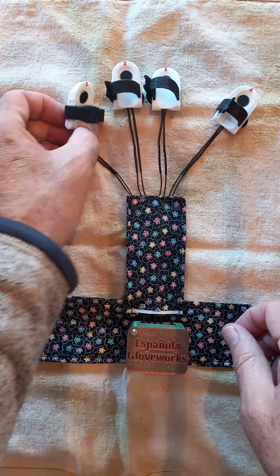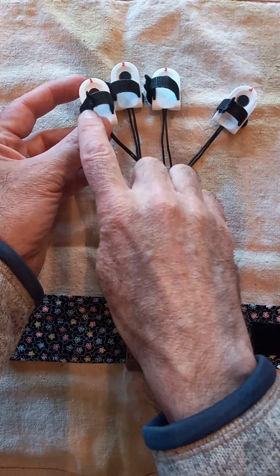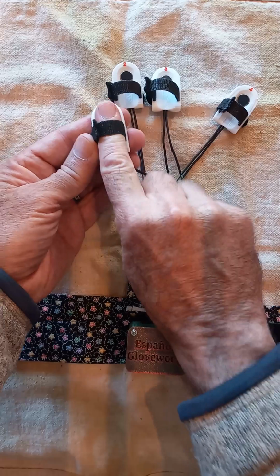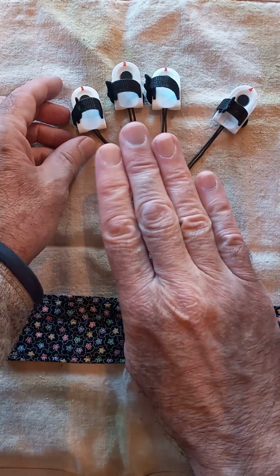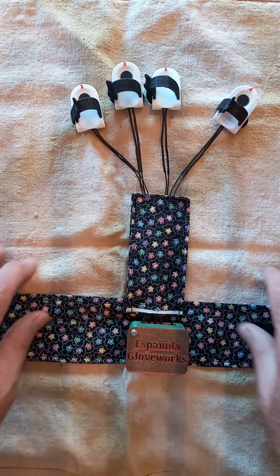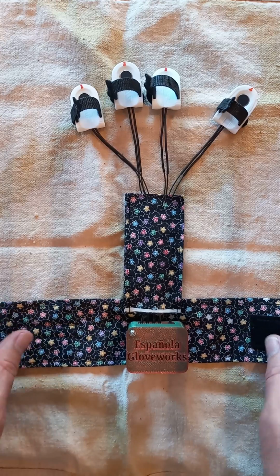The fingertips have some small numbers there, 1, 2, 3, 4, and that has really nothing to do with function. It's just a matter of helping you, once you get the Velcro twist tie around the finger to fit it tightly, then you'll know which finger is which. Different fingers come in different sizes perhaps. Don't get overly worked up about the number there, right? It's just a matter of once you do get it fit, it helps you remember which finger goes where. Cool. So I think that's the basics of it.